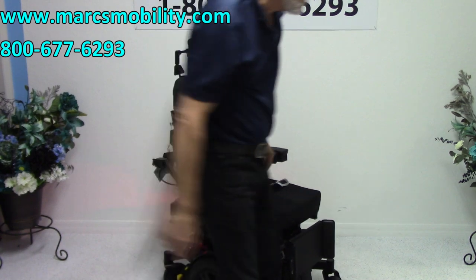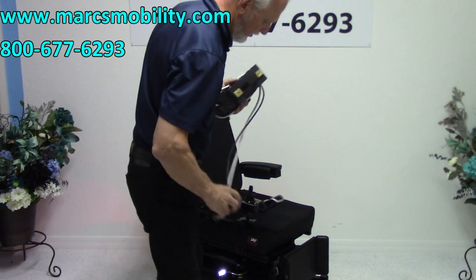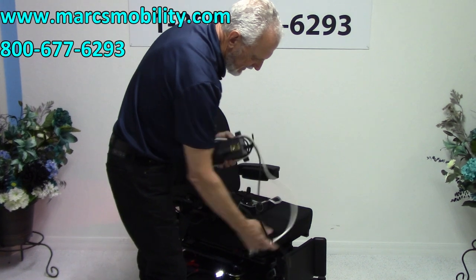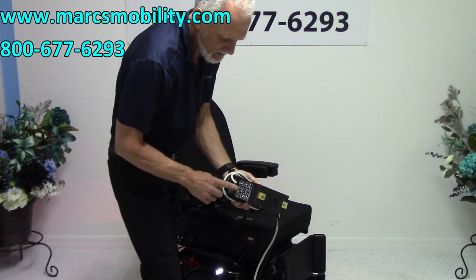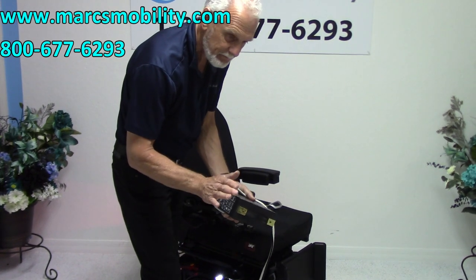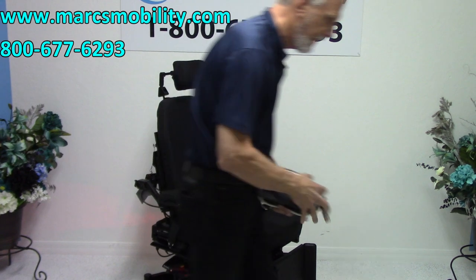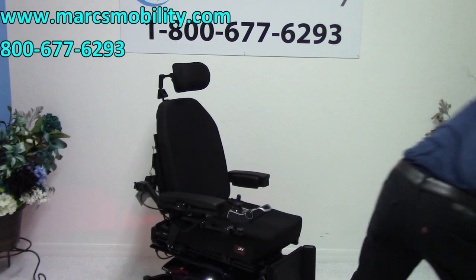When you charge the batteries in this chair, you take your Quantum charger and plug it in below your joystick. As soon as the light turns green — it'll go from orange to green — the charger will stop. The light will still be green but it will not be charging. The charger knows when the batteries are full.